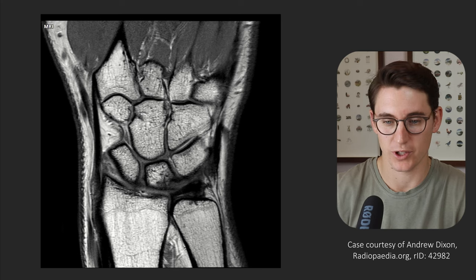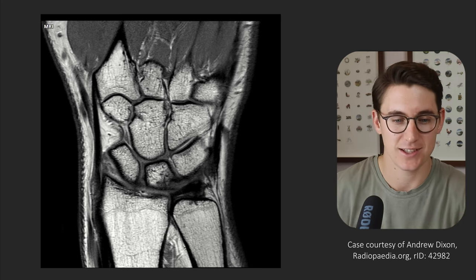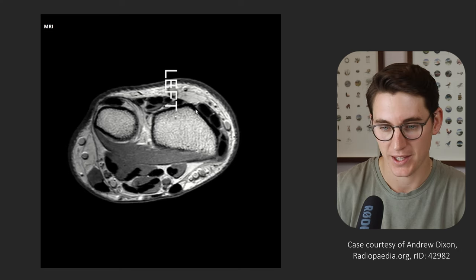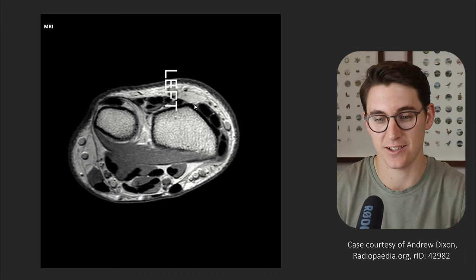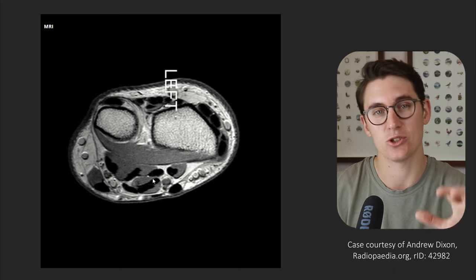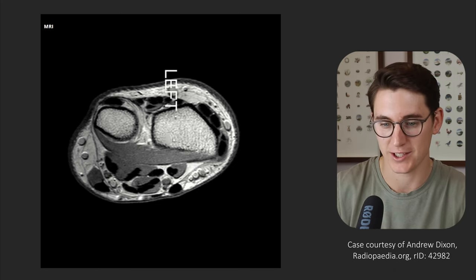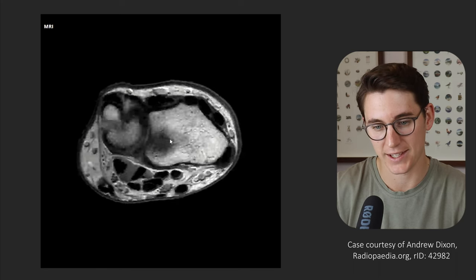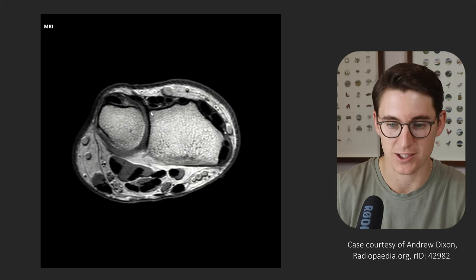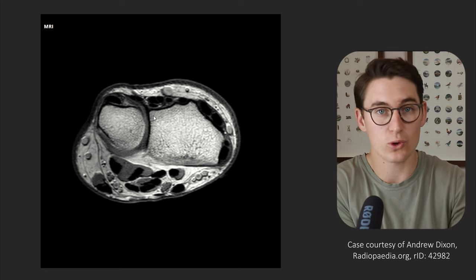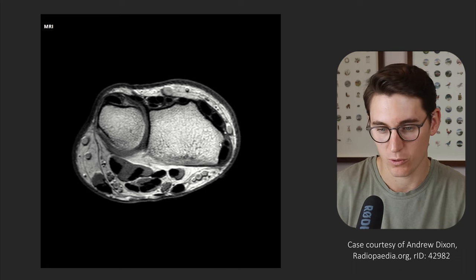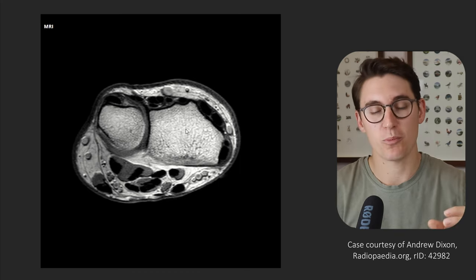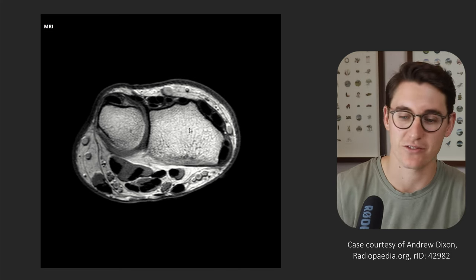Let's move on to the tendons that cross the wrist joint. The best way to look at tendons is in the axial view, cutting them perpendicular to their course. I find it easiest to scroll down to the radius and ulna so we know where we are. Here is lateral, this is our posterior surface with the extensor and abductor tendons, here is the volar surface with all our flexor tendons. Our extensor tendons — the dorsal tendons of the wrist — are separated into six separate compartments: first, second, third, fourth, fifth, and sixth.